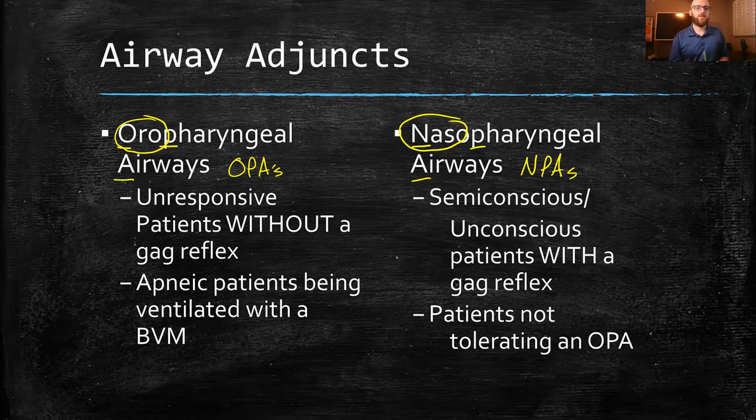All right, measurement, pretty similar to the OPAs. An OPA went through the mouth, so it was from the corner of the mouth to the earlobe. NPAs go through the nose, so we measure from the tip of the nose to the earlobe. That's the measurement there.